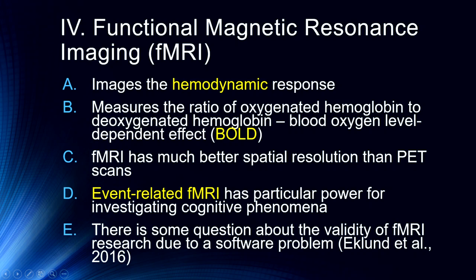Now finally, and this is very important, there's been some question about the validity of some past fMRI research due to a glitch in the software, and there's some controversy over the controversy, as there always is. But I wanted to note that, and those of you who are interested in looking into it can read that Eklund et al.